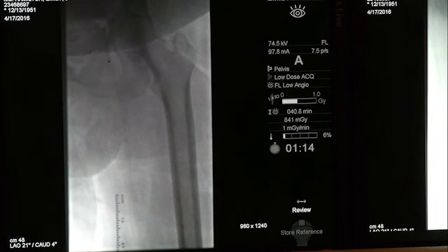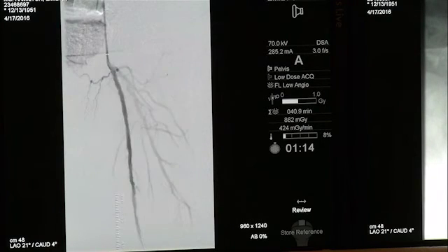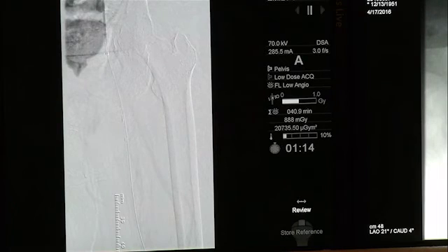Extra angle, very good. One question for my understanding. I see markers. Are you using wire bands with markers? We don't have them in Europe. I'm not aware of the new ones. They have a little bit of a marker at the tip.